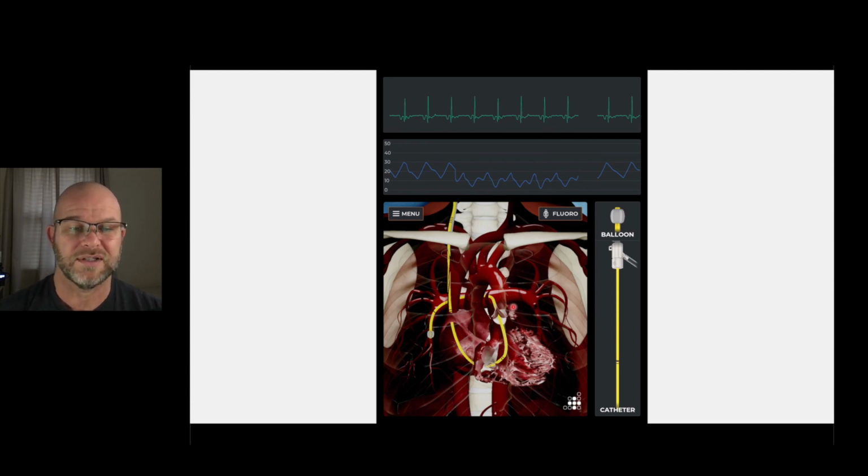We'll talk about all of these in depth, but any arterial waveform is going to look the same, whether it's the PA or you're on the arterial side and you see the aortic waveform. All of your ventricular waveforms are going to look the same, whether it's your LV, if you were doing a left heart cath and got into the left ventricle, or your RV in this situation here. The pressures will just be different. Same thing for your atria. Your wedge and your right atrial waveforms look very similar because they both represent atria.